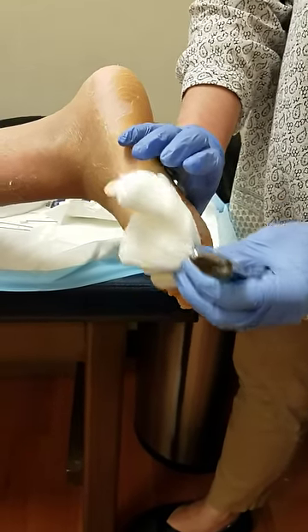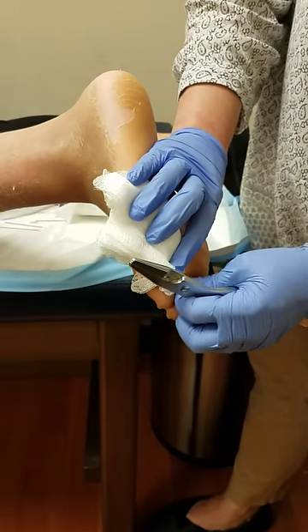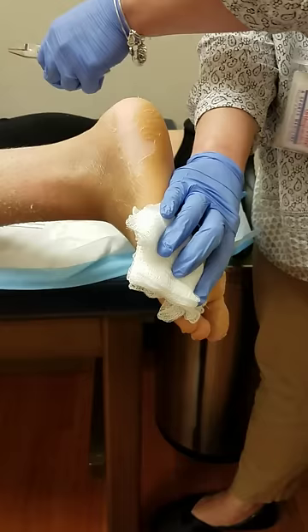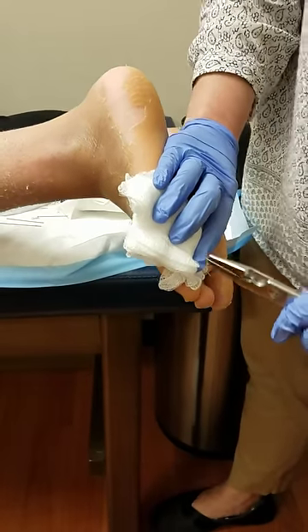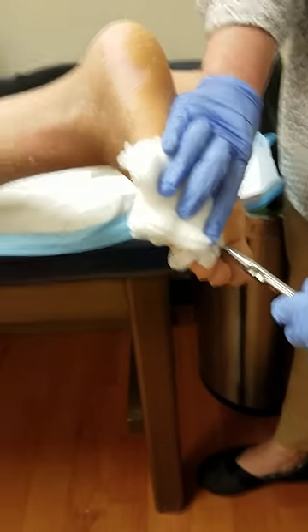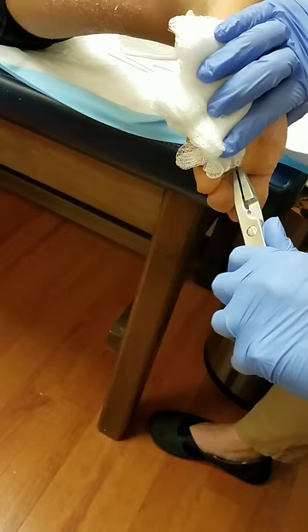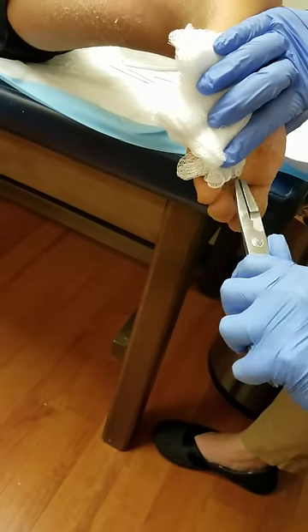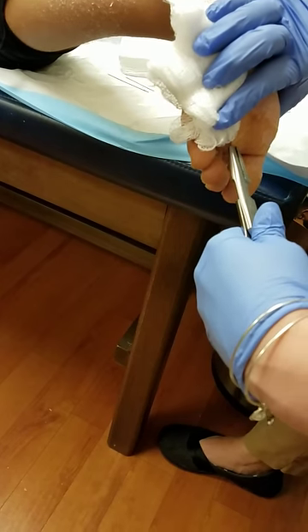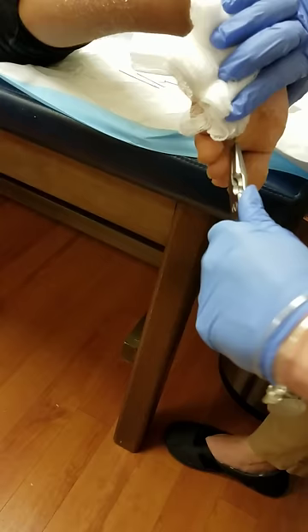You okay? You're doing it, girl. You're almost there. You're done. You're on the last one. Almost finished. That was the longest one. That's why they put the tips on there — in case it goes all the way in, you can get it out. Because there are times when they'll suck all the way in there and you've got to try to get them out. Just keep on breathing, breathe in and out and don't even look. That's the one that probably criss-crossed — they'll angle sometimes.